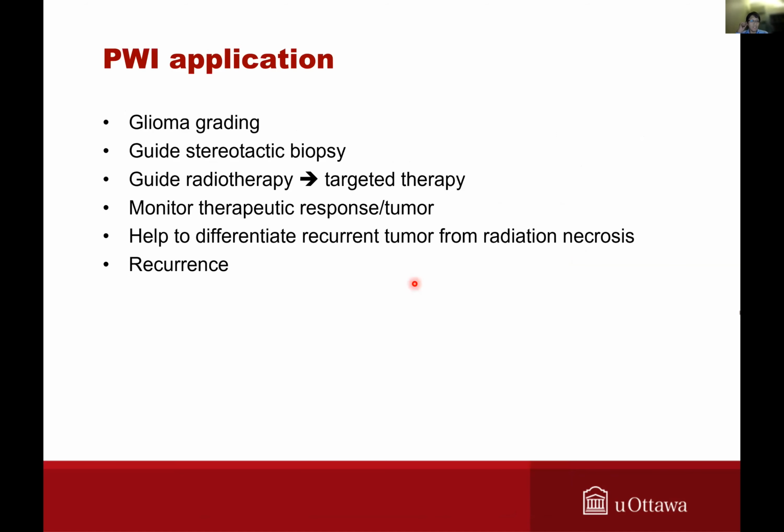So when do I use perfusion? I use perfusion when I want to grade gliomas, and when I want to guide a stereotactic biopsy to see which is the area that has a higher possibility of high grade.